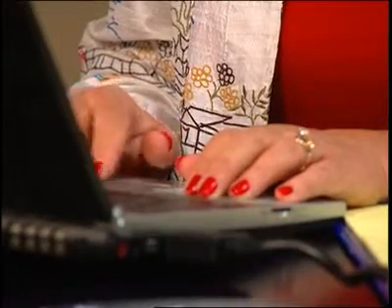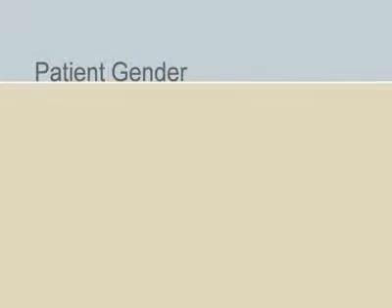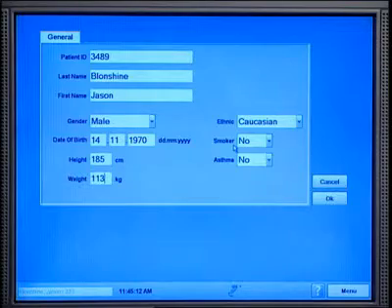Record the patient's age on the day testing is performed. Unlike weight, patient age is required for the predicted reference value. The patient's gender is also required for the predicted reference value. This is due in part to the general expectation that the average male is larger than the average female, and as such, has a larger lung volume than his female counterpart. Whenever possible, enter racial ethnicity, as the patient's race may impact the expected results and subsequent interpretation.